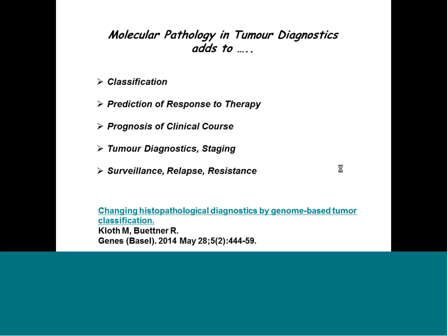No therapy will also be the best therapy. So we have to predict the clinical course of a disease. That is prognosis. Now, what will be the course and what will, during the course, be the best therapy. And finally, even in the good old tumor diagnostic staging, what is the metastasis, what is the primary tumor, genomic information has a lot to tell and is modifying our way of thinking. And also, I will very briefly touch the question of surveillance, how to monitor a tumor disease under treatment, and to predict emergence of resistance and relapse.